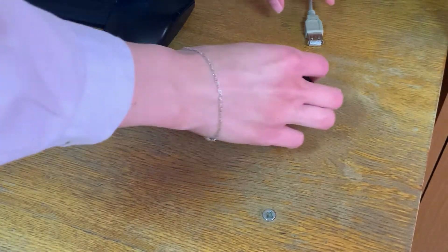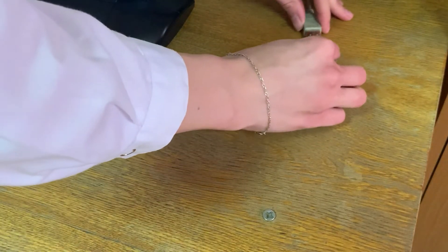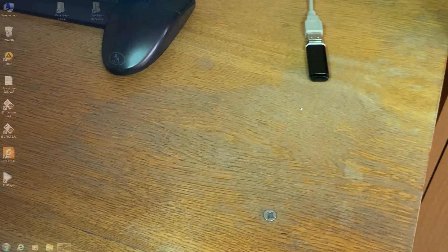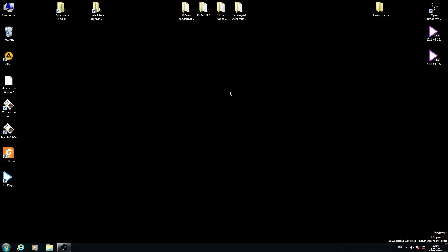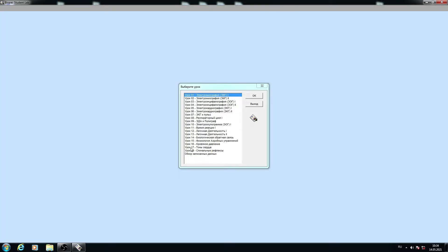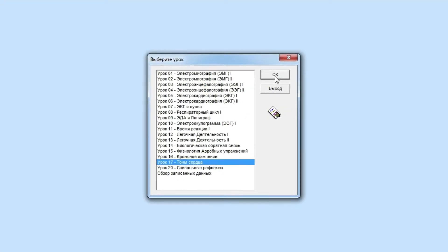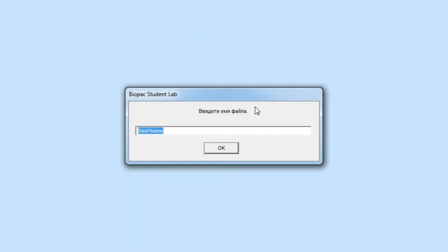Insert a small flash drive into the computer. Start the Biopack Student Laboratory program BSL 3.7. Select Lesson 17, enter the group number and patient surname, then click OK and proceed to the setup procedure.